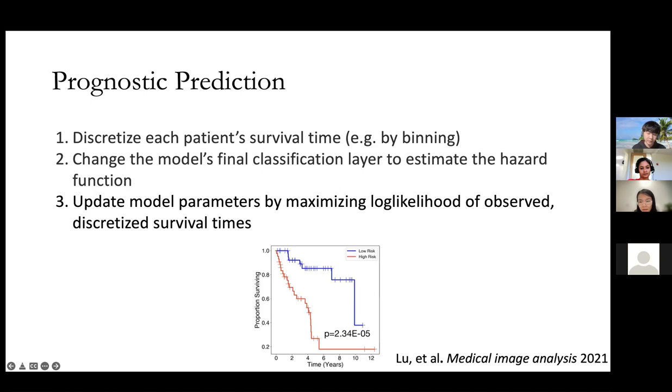I see. Do you find this loss function more beneficial than some regression loss functions, like Cox regression or similar survival losses? We've actually not tried other loss functions. One of the reasons we picked this particular setup is a computational limitation of our method: because each whole slide image has a different tissue area, if you're using fixed-size tiles, you're going to get a very different number of tiles across different training examples. You can do some clever padding and batching to stick multiple slides into a single mini-batch, or do distributed training. But from an ease-of-implementation perspective, it was really easy to just use a batch size of 1, and we didn't find any issue with that for the classification task we did.